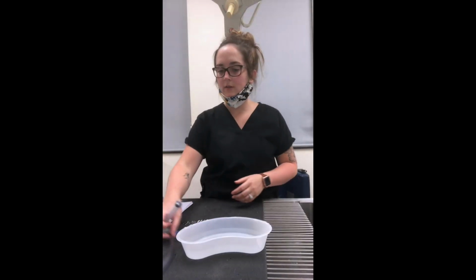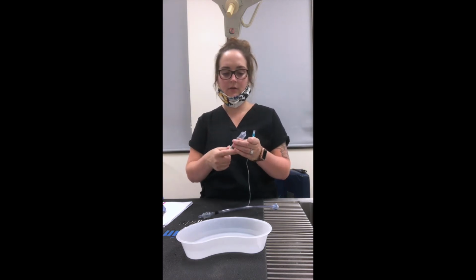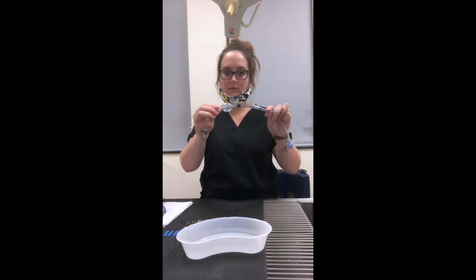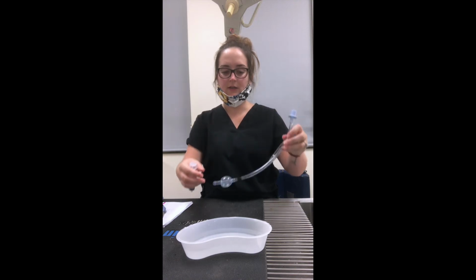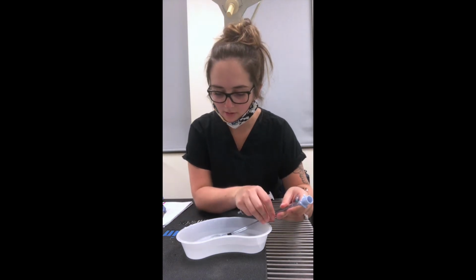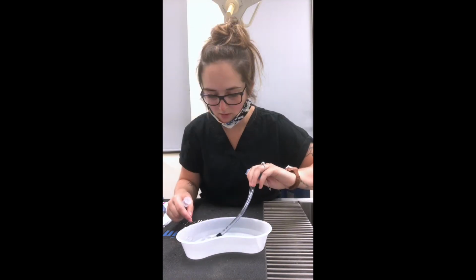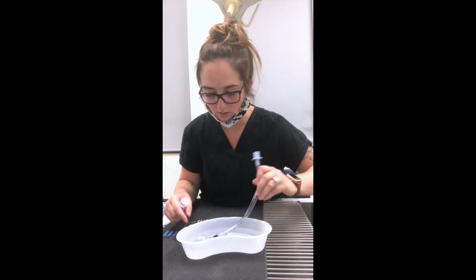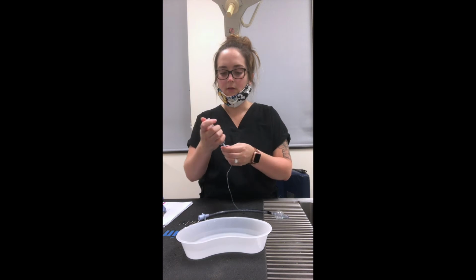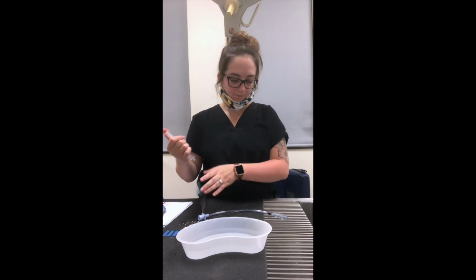So to properly leak test your endotracheal tubes, you're going to get your syringe and inflate it until your cuff is completely inflated. You want to submerge it in water, and if you see any bubbles anywhere, as well as where your tube meets, and if it stays inflated and there's no bubbles in the water, then you have a tube that is not leaking and is okay to use for surgery.